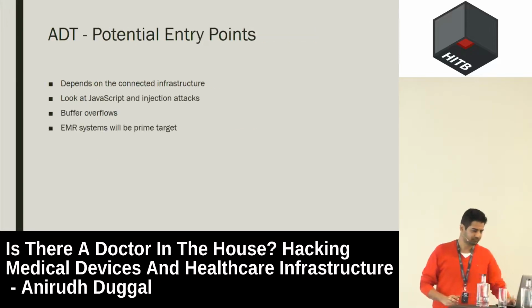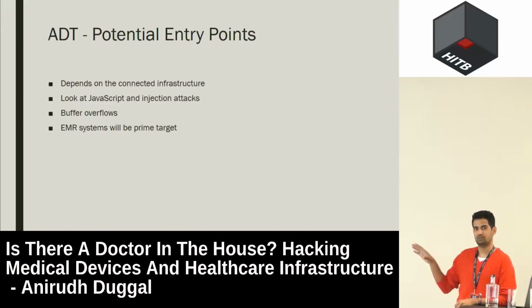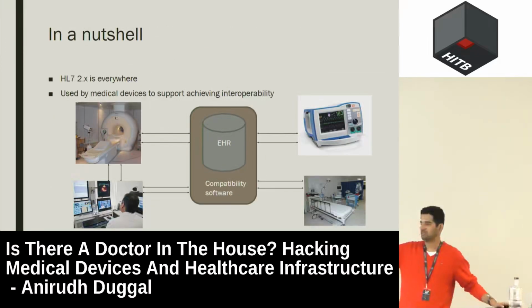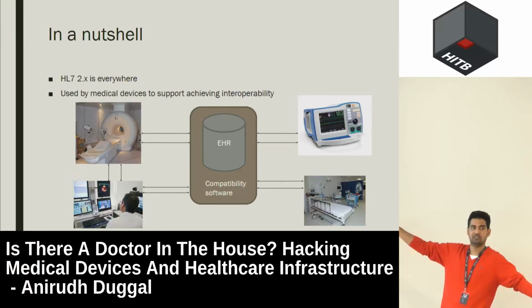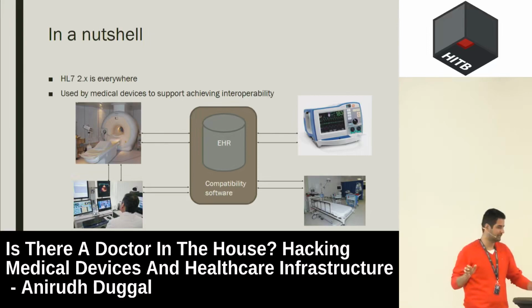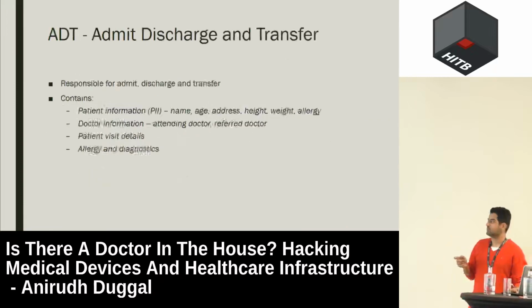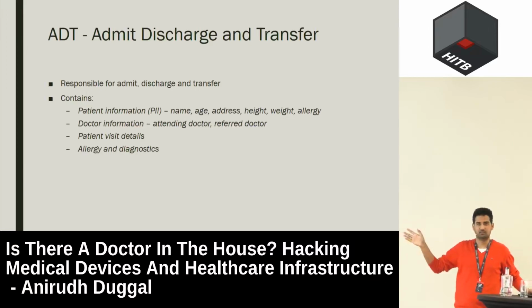So yeah. What can you do with these messages? It really depends on the infrastructure. You can actually inject JavaScript into it because of the nature of these messages. Just remember this diagram. You have a doctor's terminal which has a web client running over it, and you have a patient monitor where you can inject these payloads. You just need to hijack that stream, right? And we'll see how we hijack that stream and why this stream can be hijacked. So there are multiple entry points. When you're talking of ADT, just remember that you can target doctors, you can target their terminals with it.